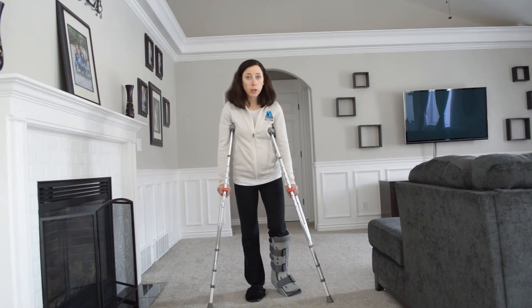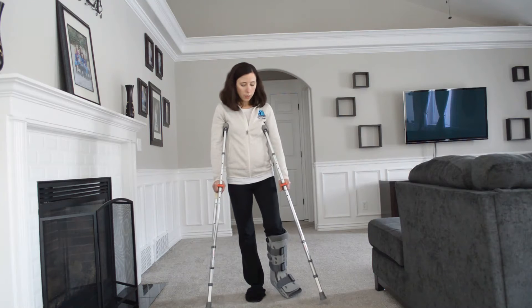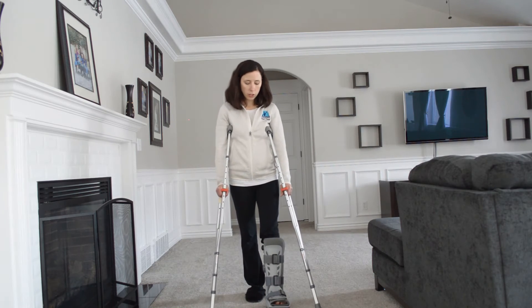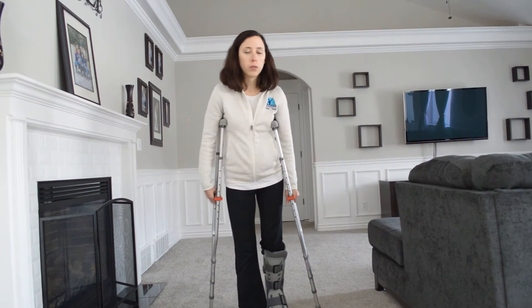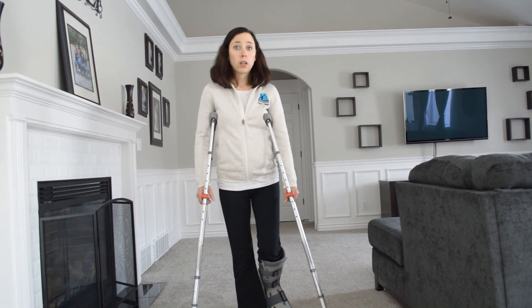The next step in progression, once you're given the okay to start putting weight into that foot, is to move the crutches with your injured side. You're going to put the crutches down at the same time as your injured side, and then bring your other foot through, so that when you're lifting your crutches your weight is in your strong side.